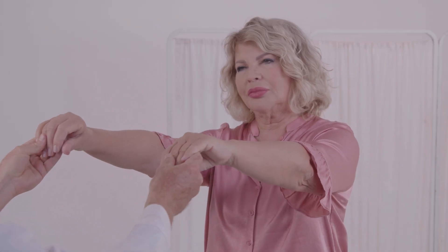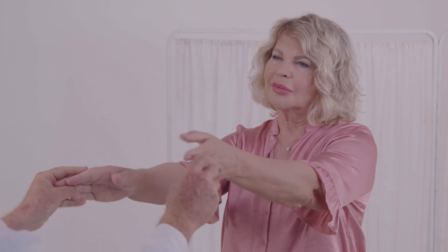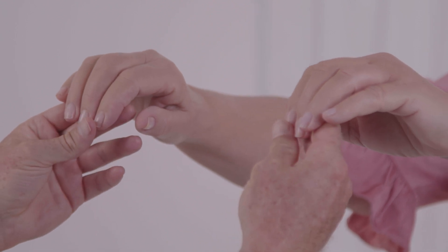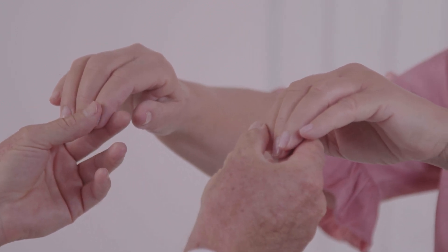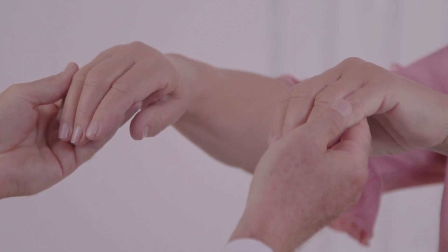Please inspect the patient's fingers for any injuries and deformities that might affect the study. Make sure fingernails are trimmed. The index finger is the preferred finger for the study. However, if the finger is too large, you may choose any different finger except the thumb. Make sure you use the same finger for both hands.